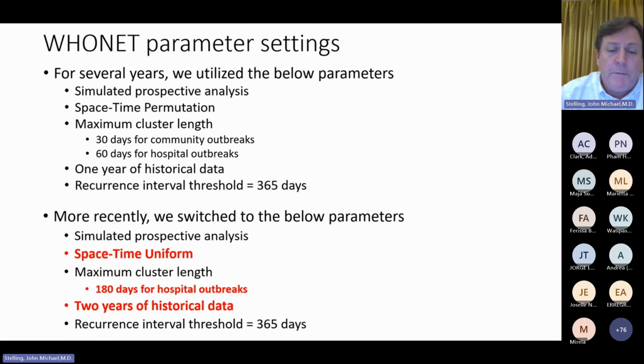But I don't want to say that's the correct number. Maybe 90 days is sufficient. The truth is, it makes a difference, but it often doesn't make a big difference. And I will talk about that in one of my last slides about parameter optimization. So we don't know what the best set of parameters are, but we're trying different things out to see what works best for us in our hospitals. But yours will be different given the size of the hospitals, the resistance issues, sampling rates.